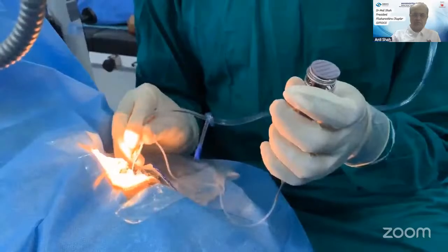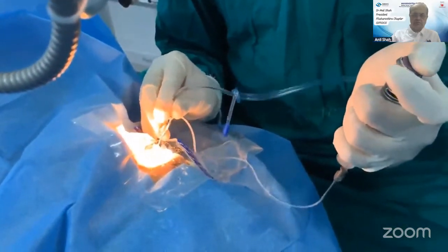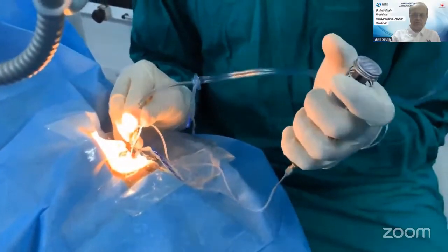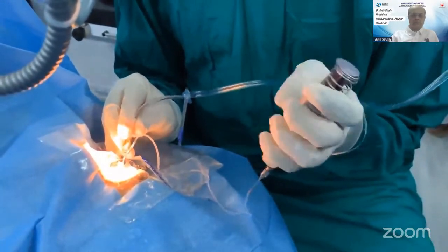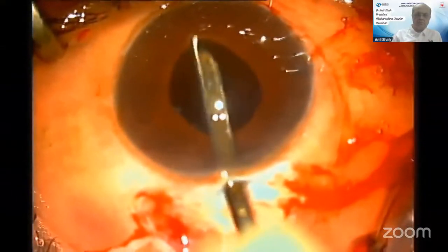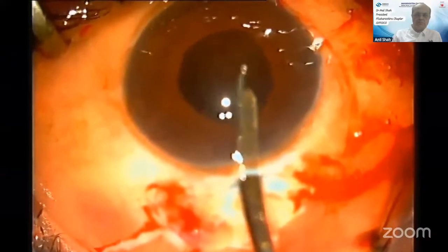The initial phase has a controlled but dynamic vacuum which gradually decreases during the later phases, leading to slower aspiration. We can manipulate the rate of aspiration by keeping a hold on the flange, limiting the relaxation of the spring. The controlled vacuum produced by VCR avoids any sudden aspiration of ocular tissue as with traditional Simcoe and hence minimizes the risk of posterior capsular rent. Also, any inadvertently caught iris tissue or posterior capsule can readily be flushed out.